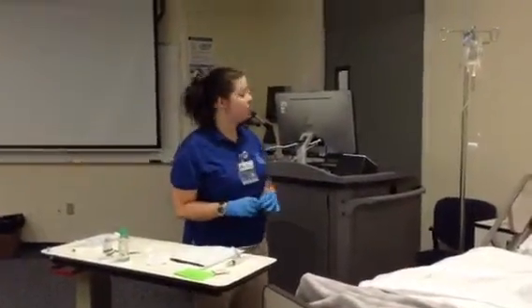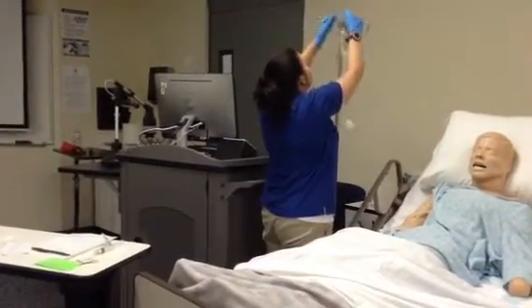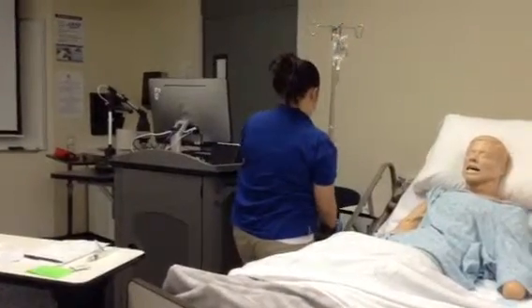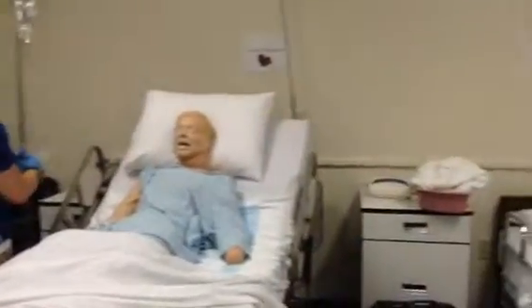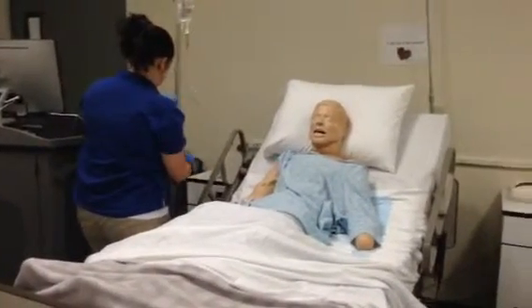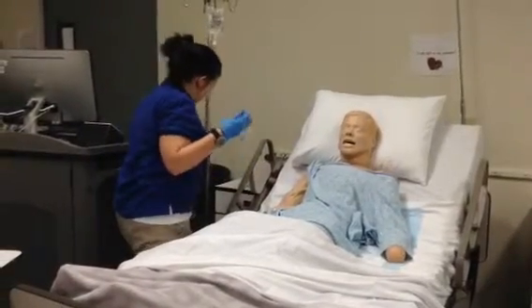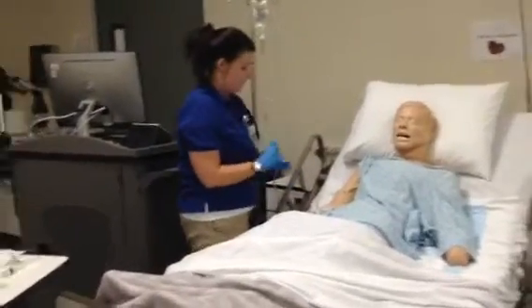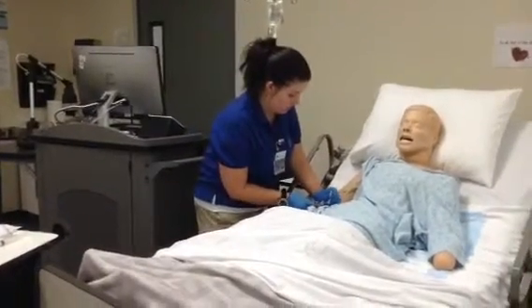Now we're getting ready to hook up my vancomycin. Clamp it. Just good to go. Alrighty. We did unclamp that. It's done. Clean my site once again. Okay. Clean my site.